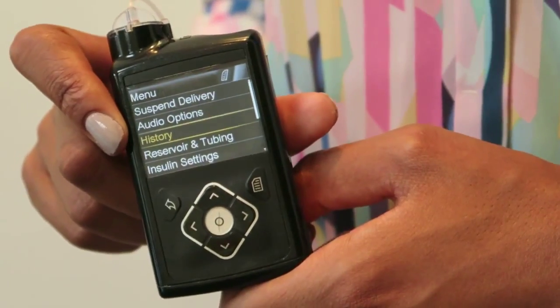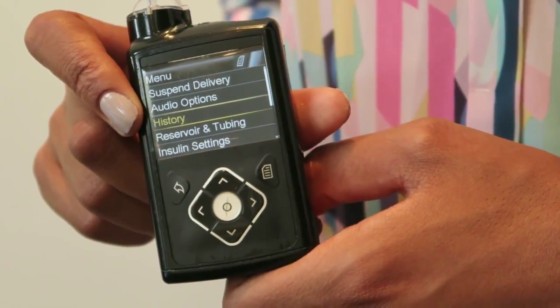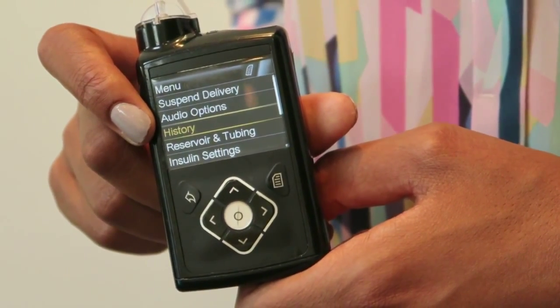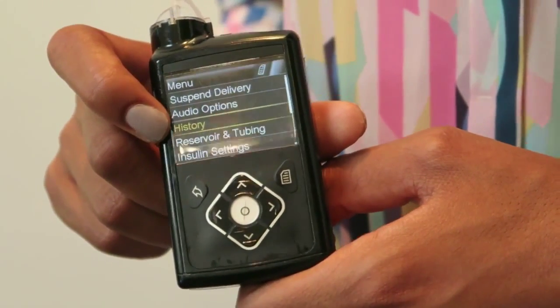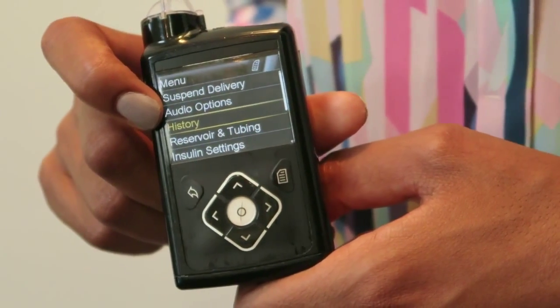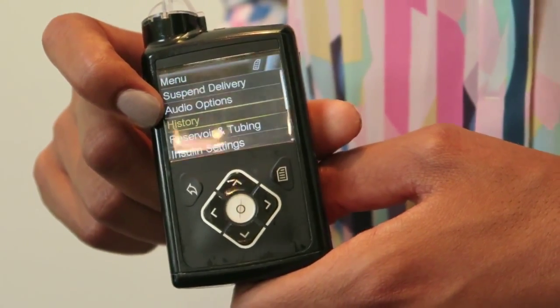The history option is something that's really handy about insulin pumps compared to injections, in my opinion, because if you think that you've forgotten to take your insulin, with an insulin pump you can just check back and see whether you've taken it or not. This gives an account of the last day or the last couple of days to see what's been going on, so you can look at your total daily doses as well.